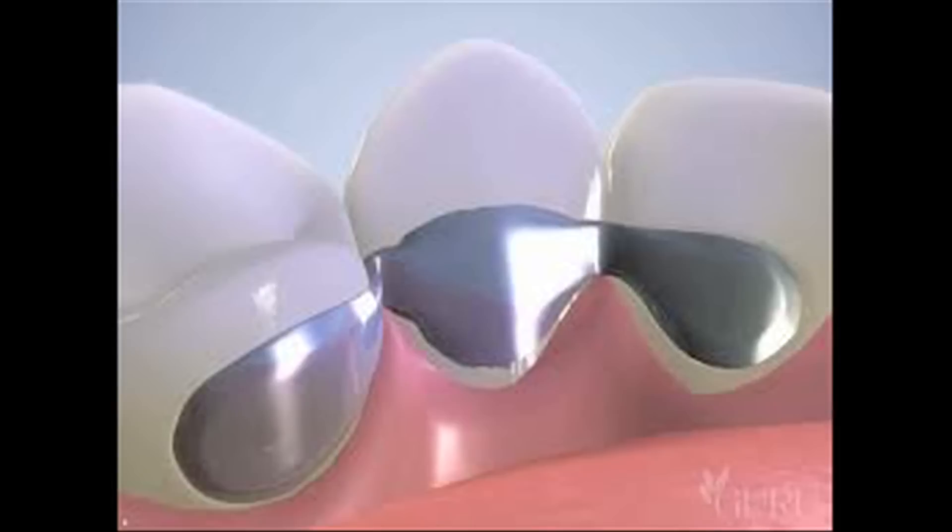This is more traditionally known as a Maryland bridge. It's a great way to replace a tooth and it can look very cosmetic.